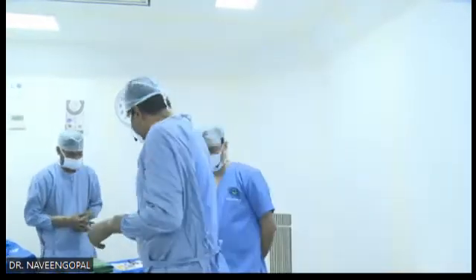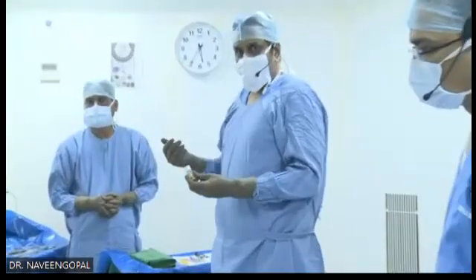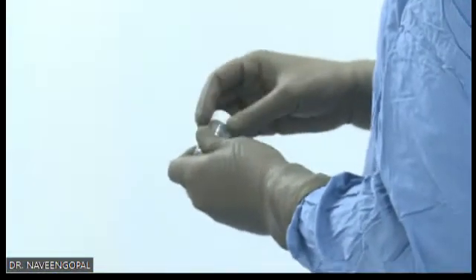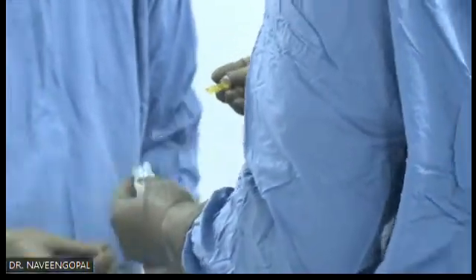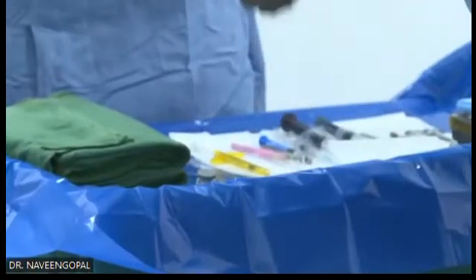Next thing is the ICL will come in a bottle like this. Zoom. Can you zoom or bring it in? Open it. Before that, saline wash.